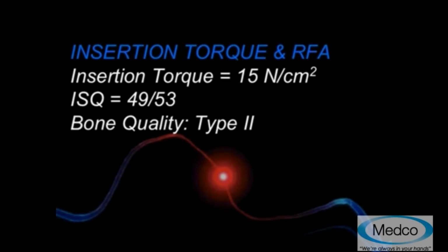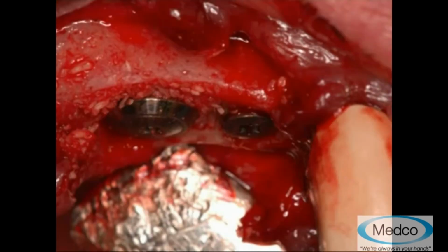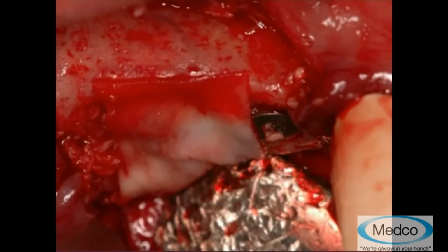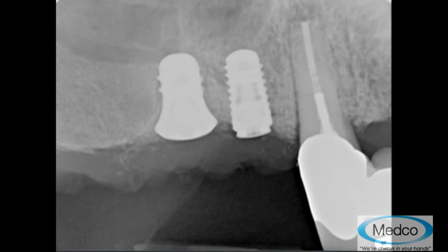is not making me feel very comfortable. But I felt reasonably good stability, and what I did here was I submerged this implant after grafting it, and arbitrarily I gave 4 months worth of healing.